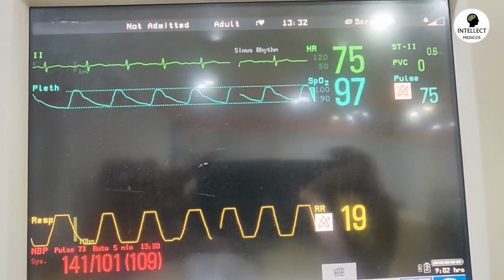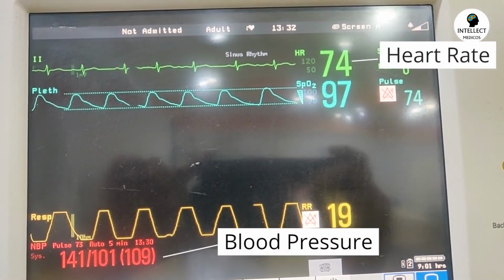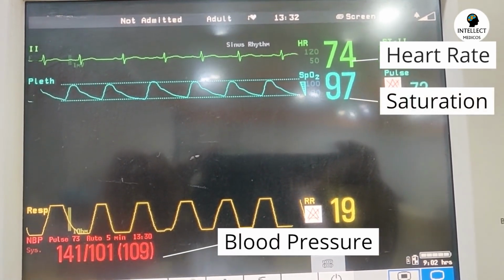So now after giving all these medications, one needs to keep an eye on the monitor also. I mean, you need to see the heart rate of the patient, the blood pressure of the patient, and the saturation. It's not like you just intubate and don't see the vitals. That is a very, very important task. So you need to ask your nursing staff or your attendant or your colleague to have a look at the monitor while you are performing this procedure.